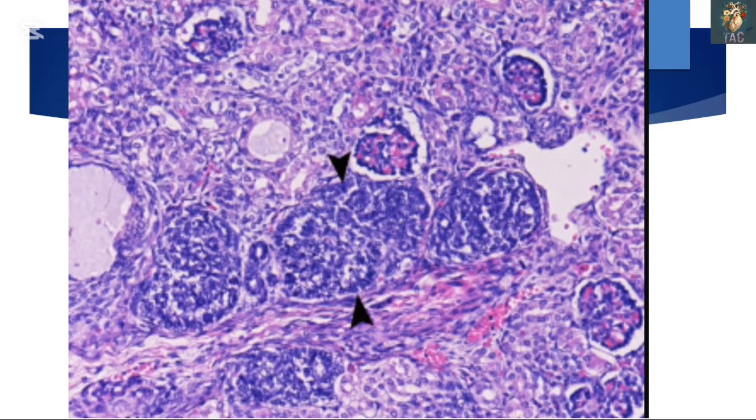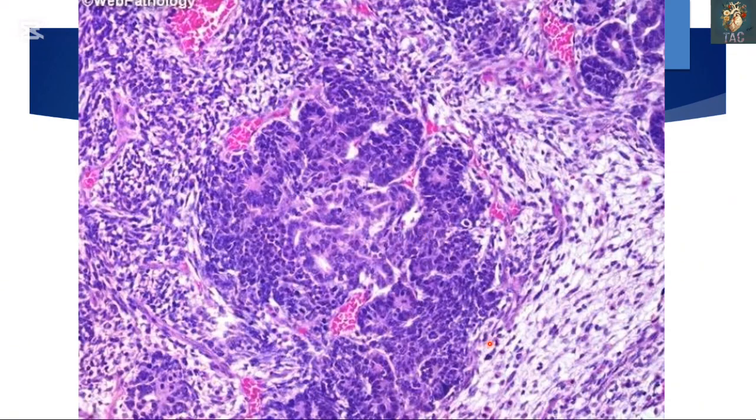You can see over here again round blue cell tumor infiltration. These round blue cells have hyperchromatic nuclei, hyperproliferative epithelia, nuclear atypia, that is nuclear pleomorphism, all are hallmarks of anaplasia, which is characteristic of any malignant neoplasm. So, another view of Wilms tumor, round blue cell tumors, desmoplastic reaction, and the primitive glomeruli and tubules. Together they form pediatric renal malignancy with triphasic histology known as Wilms tumor or nephroblastoma.